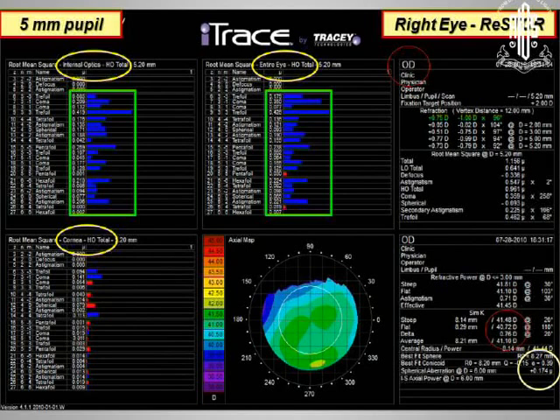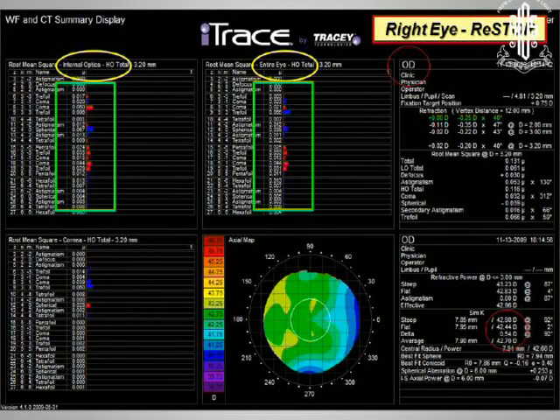So where are his aberrations coming from? Where is the quality of vision being affected? It's from the internal optics. It's the IOL. Now you're probably going to say, well, I know multifocals, there's a compromise in the optical quality. Don't they all show that? So here is another patient, different patient with the restore, and you see there's no aberrations from the internal optics or the entire eye.